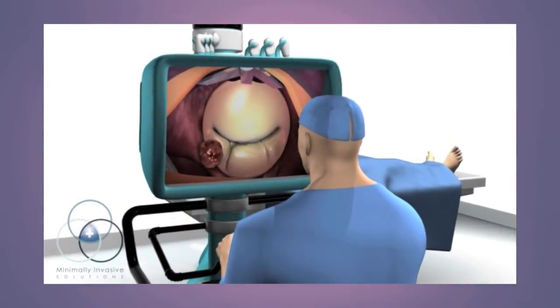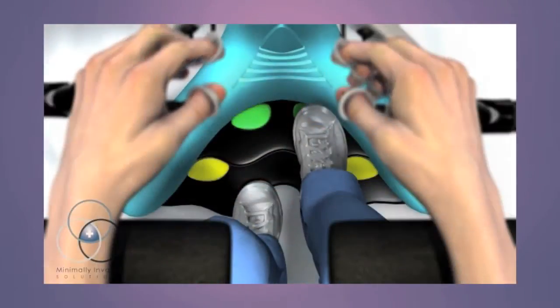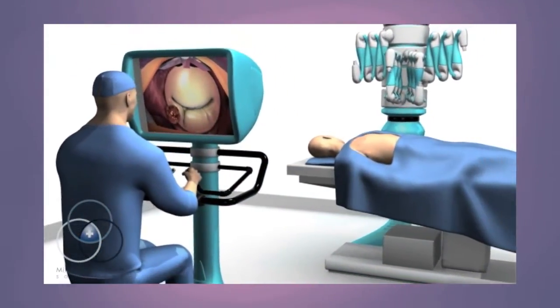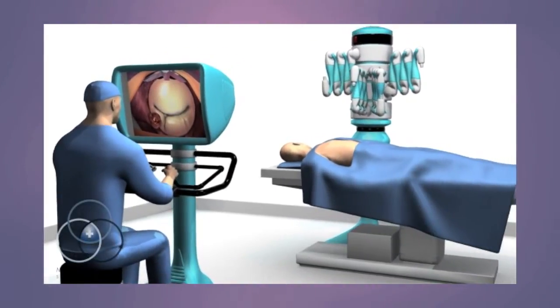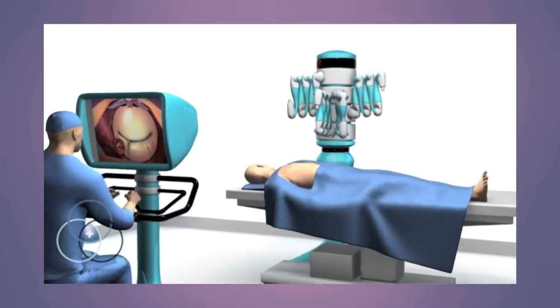The surgeon sits at a console controlling the robot's arms and camera using a combination of foot pedals and hand controllers. This combination enables the surgeon to perform very complex and delicate surgical maneuvers through smaller incisions than traditional surgery.